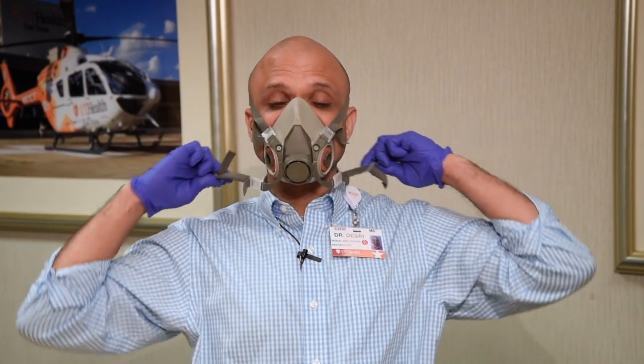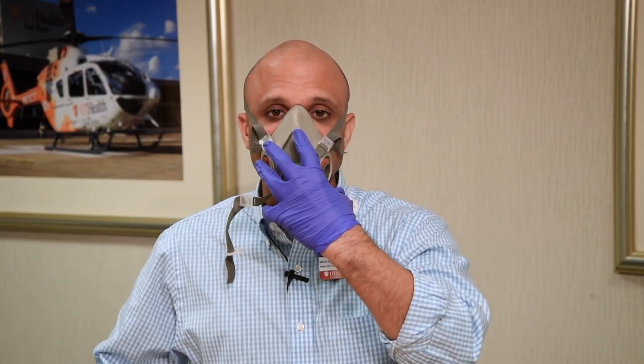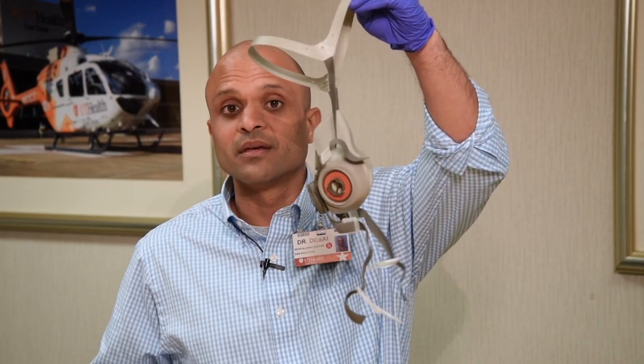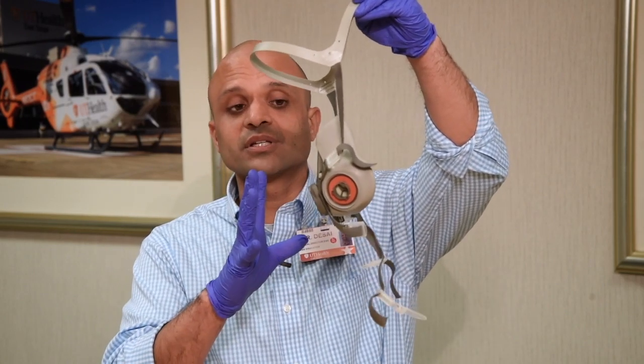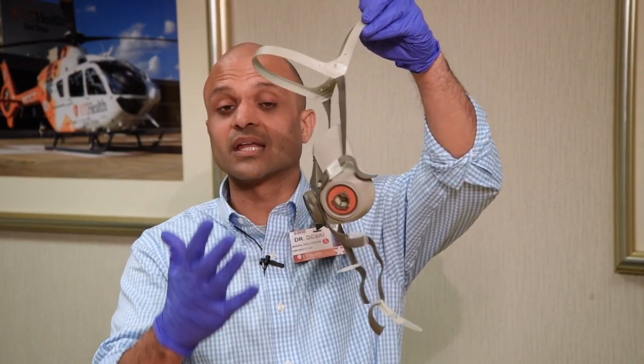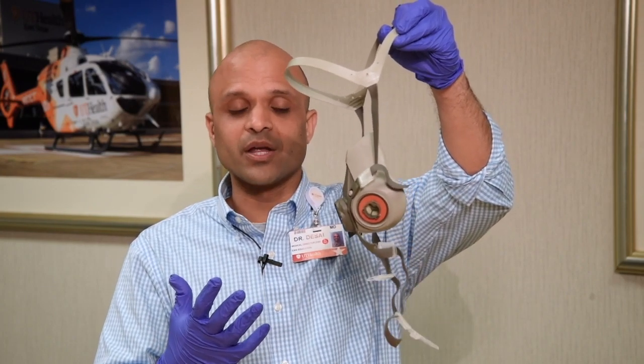The first thing you're going to do is unsnap the neck straps from around your neck. Then rather than grabbing the actual front of the mask, which is considered contaminated after you've had patient contact, you want to grab it from the top halo and pull it off. Therefore, you never actually touch any part of the front of the mask, which is again considered contaminated if you've run on a potential COVID patient.